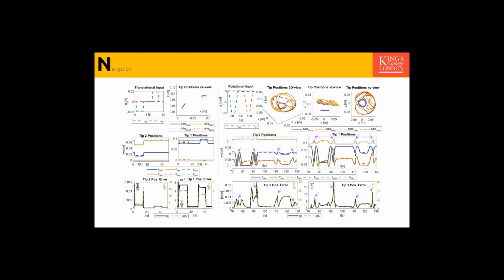That's actually a good question. I would love to see reviewers of papers asking that question, not letting a paper pass without rigorous analysis of the whole workspace, not just by showing a single successful or a few successful instances. But back to your case, yes, lack of robustness is an issue of data-driven methods. Model-based data-driven methods can get the robustness from the physics-based model, and then the accuracy and the adaptability to special cases like different patients from the AI part. So that might be a solution to that.